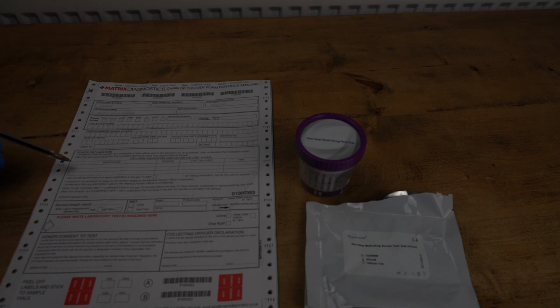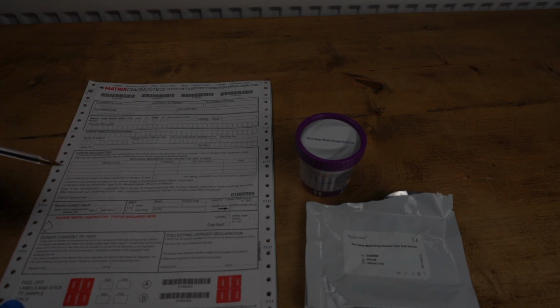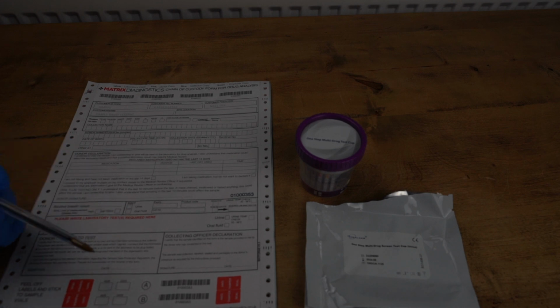Underneath that, you're going to need to state what medication they've taken. You've already done the first line test consent form, which you filled out when you asked them to urinate into the pot, and you would have asked them what medication they've taken in the last 2 weeks. You'll simply need to transfer that information onto this form now: the medication, the dosage, the day they last used it, and the time.